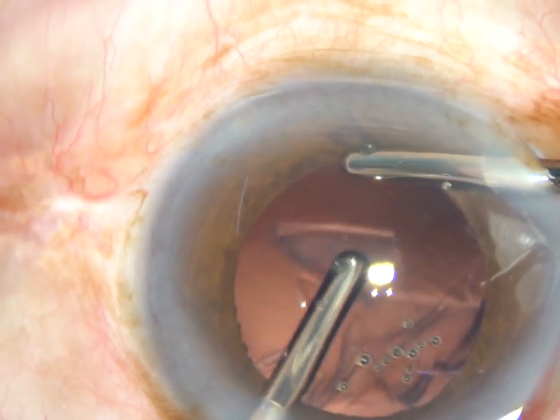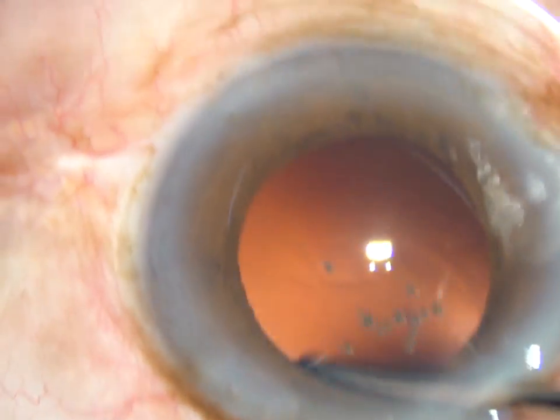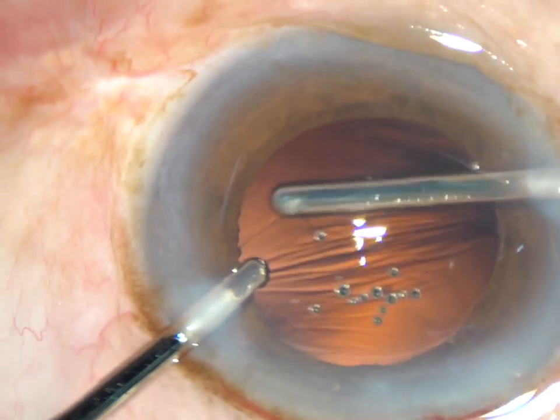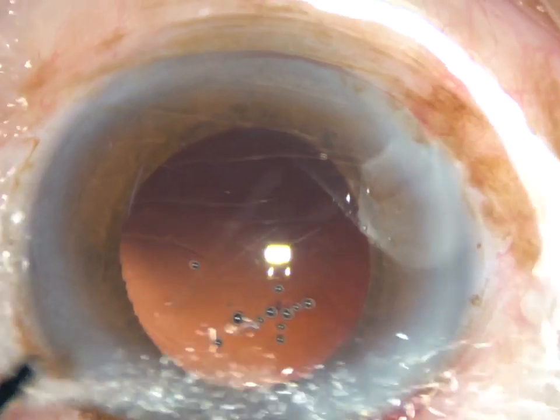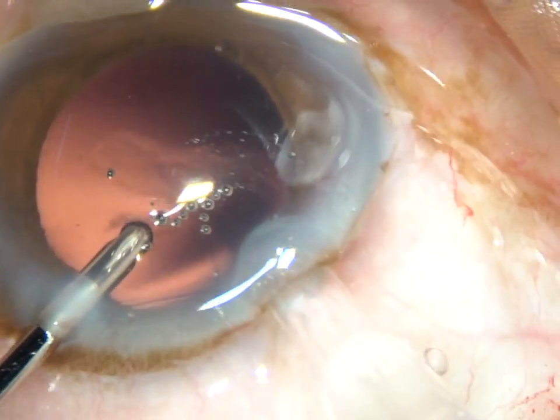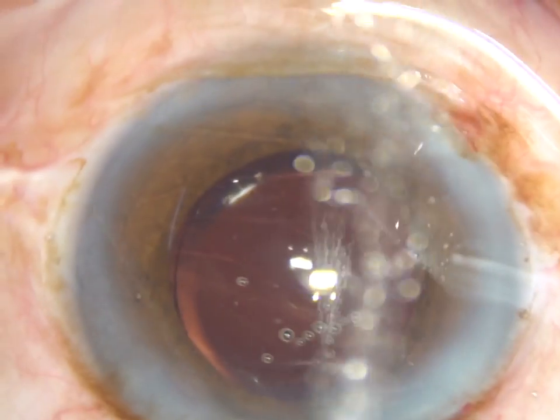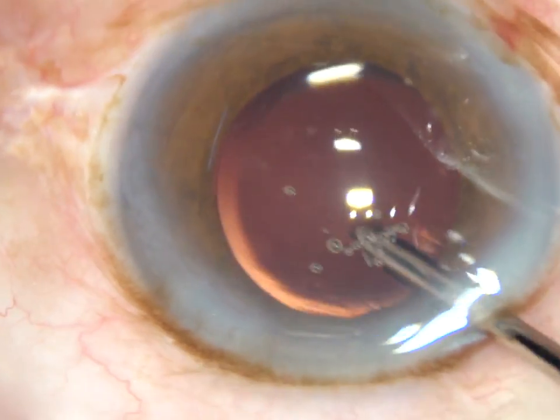This is a fantastic machine and according to many surgeons, the holding capability of this machine is much better than Alcon's Centurion. It's not my opinion — it is the opinion of many surgeons who have already used this machine. Alcon's machine cuts better, but the holding capability of this machine is fantastic with adequate vacuum and flow rate.